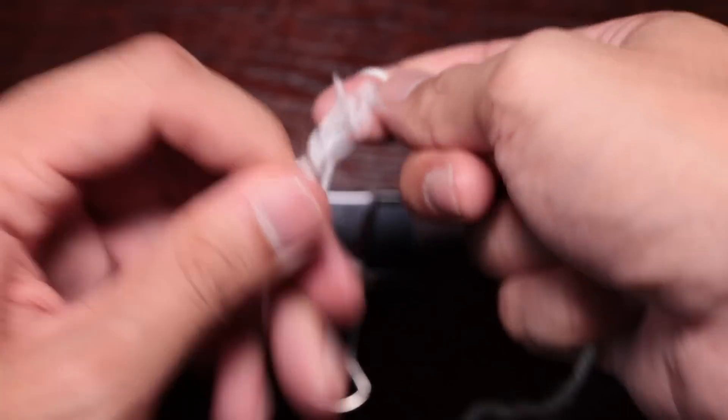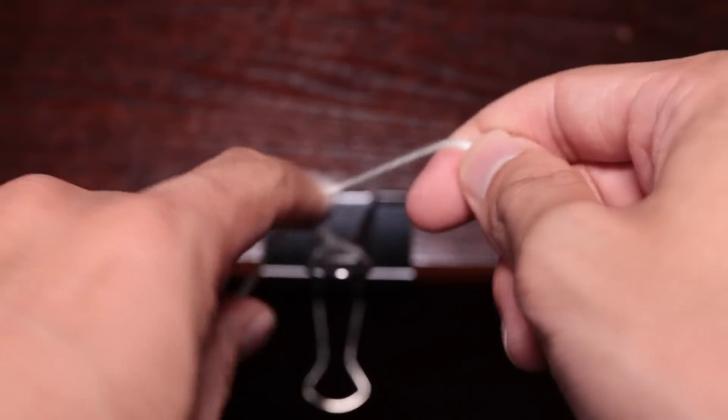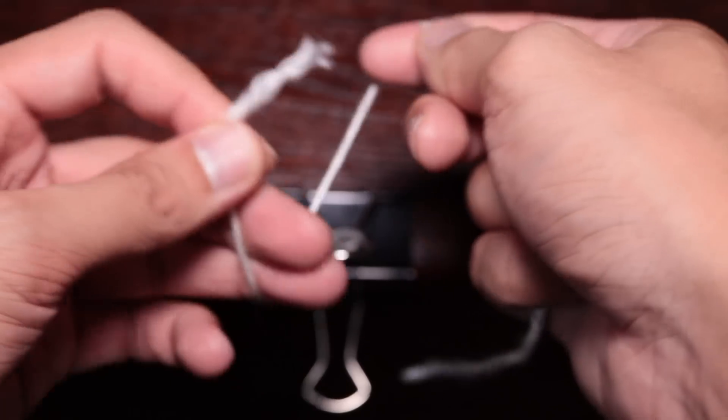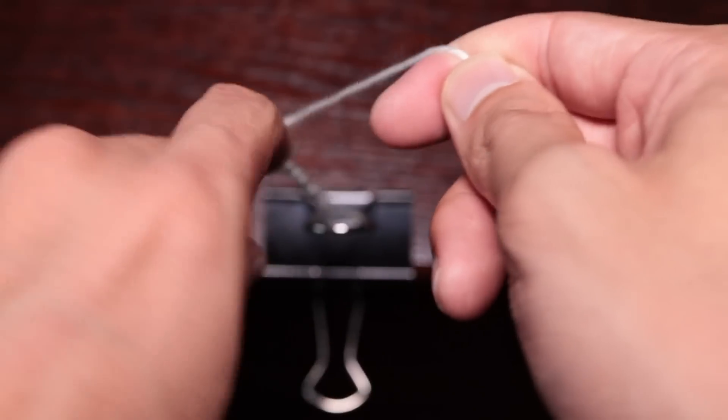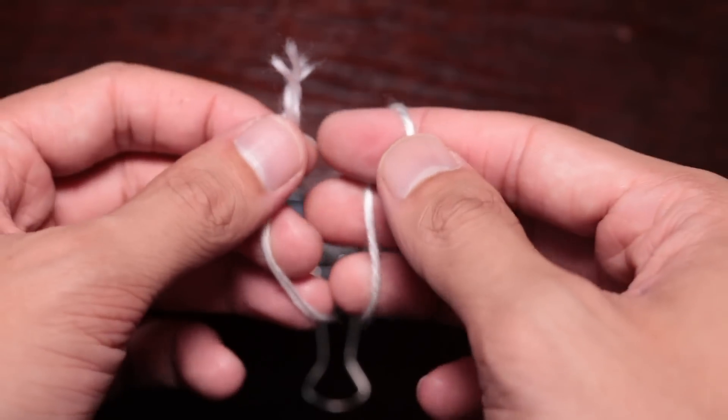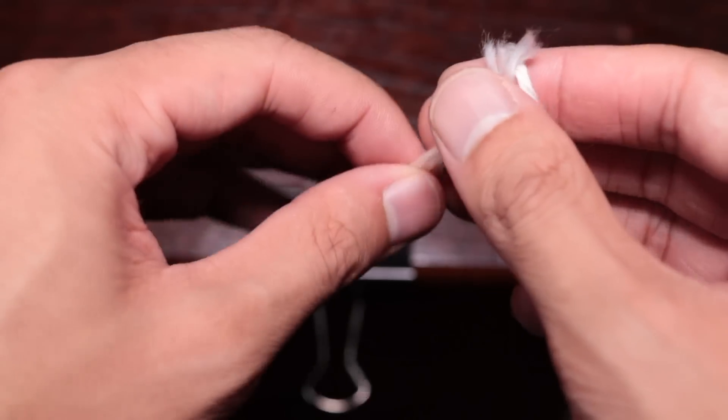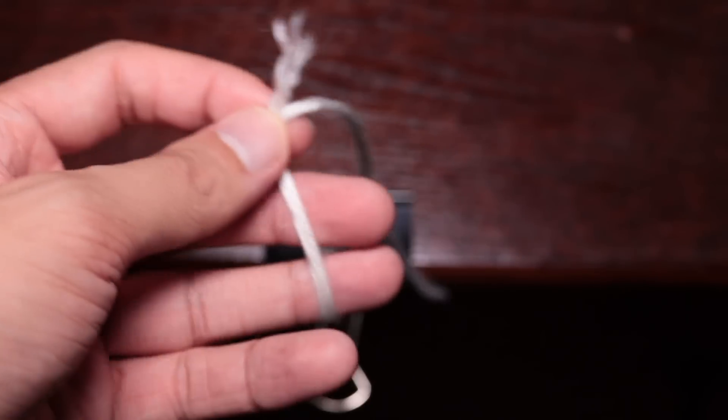Up to speed it can look something like this. Obviously this is for practice and there's never a time where you're going to be doing 20 knots. You're probably going to do 5 to 7 or even 10 sometimes depending on the type of suture. But to practice you can go as far as you like and then the string gets shorter.